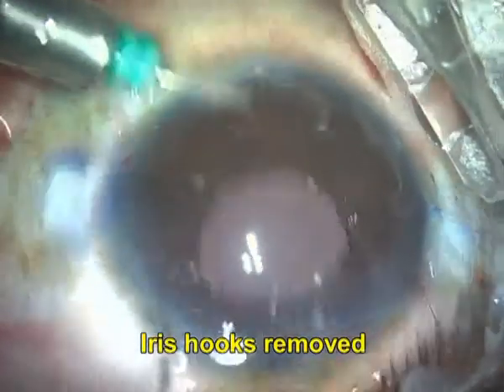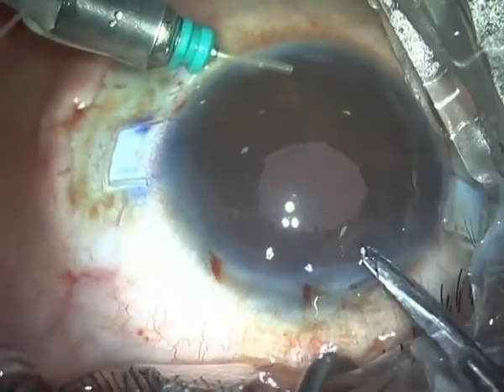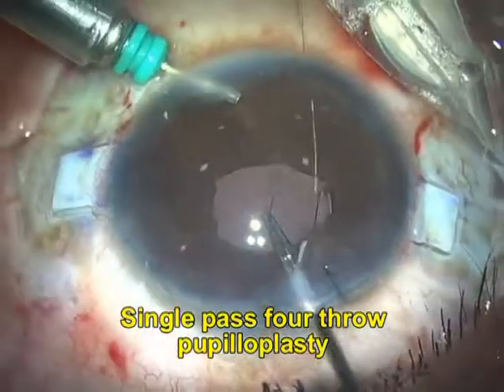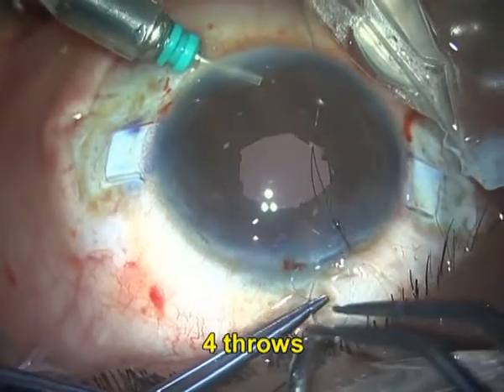I closed the case with a pupilloplasty technique called a single pass four throw, where I'm taking a single pass, throwing the suture four times, and closing the iris.